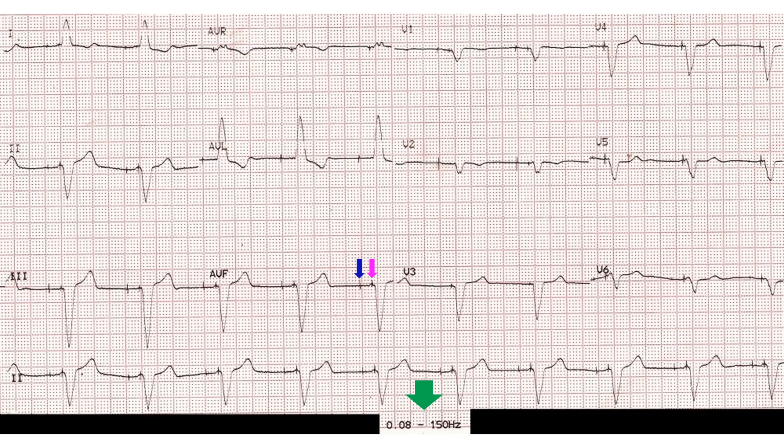The pacemaker spikes are easily seen when the same ECG is repeated with a change in the low pass filter to 150 Hz. In fact, both atrial and ventricular pacing spikes are seen before each QRS complex with an interval in between. Hence, this person has a functioning dual chamber pacemaker in situ.